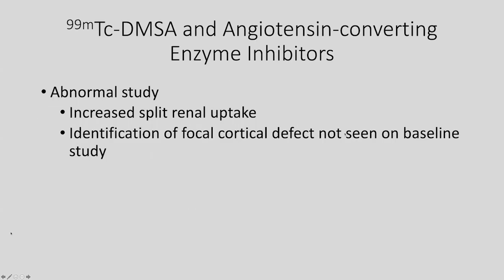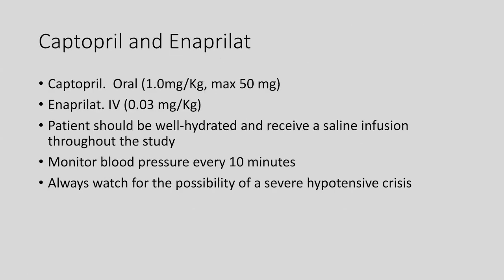An abnormal study after using angiotensin converting enzyme inhibitors results in an increased split renal uptake and identifying focal renal defects that are not seen on baseline studies.